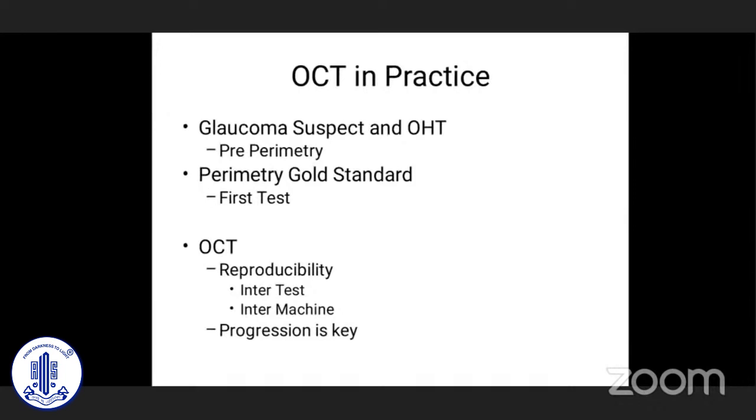So it's the inter-test variation which is so large with OCT. If you do it today and half an hour later, or the next day, or after 6 months, the results may not be the same. And the other is the manufacturer. With one type of machine to another, if the patient gets it done from another doctor with another machine and comes to you, you cannot rely on the reproducibility. So that is the main thing. Hopefully this will be corrected with the software in future.